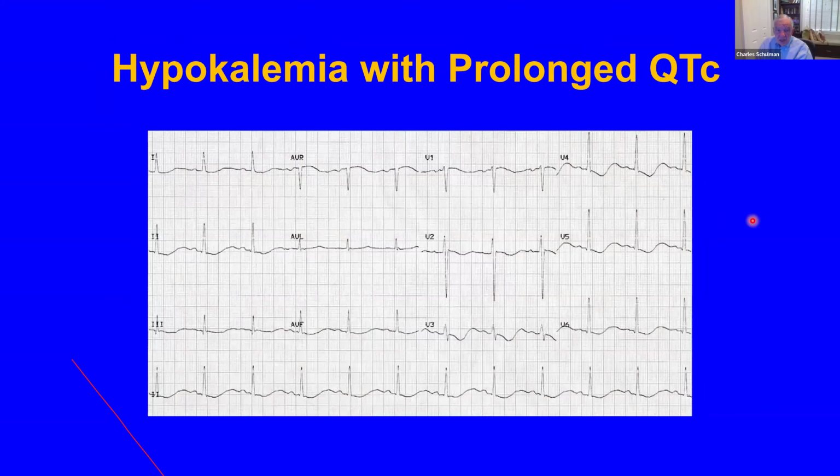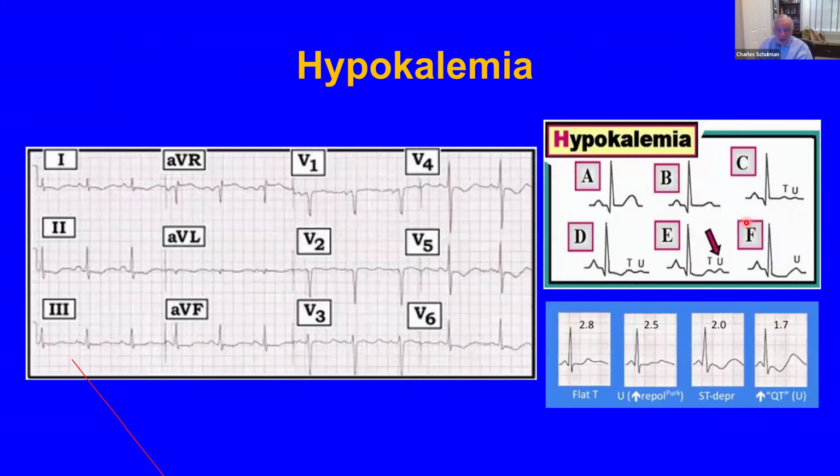Here is hypokalemia with diffuse ST-T changes, as you can see here, and prolonged QT.